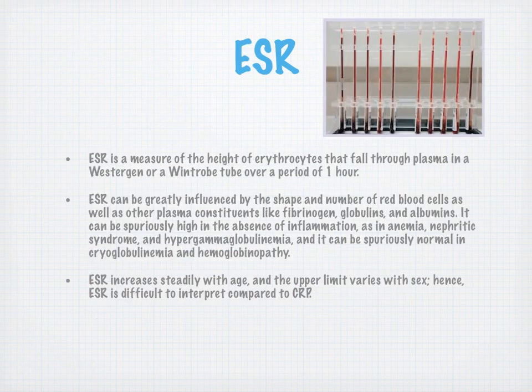And the ESR, as we've talked about in class, is just a measure of the height of the red blood cells that's going to fall through plasma in a specific tube over a period of 1 hour. So the measure of the height of erythrocytes.